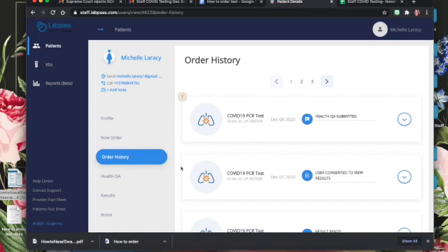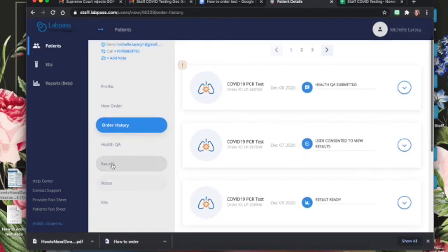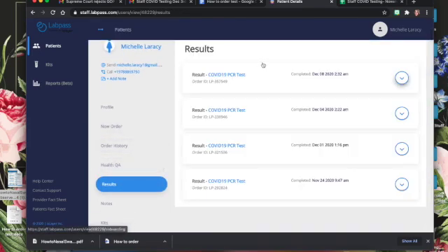After your label has been printed, you're going to want to place it down the side of your test tube, making sure there's no creases, no wrinkles, no smudges, that it's as straight as you can make it because it's a barcode, and if it gets to the lab and the scanner can't read it, it could compromise the test, and the test results will come back inaccurate, and your staff member will have to come back and repeat the test on a later date.